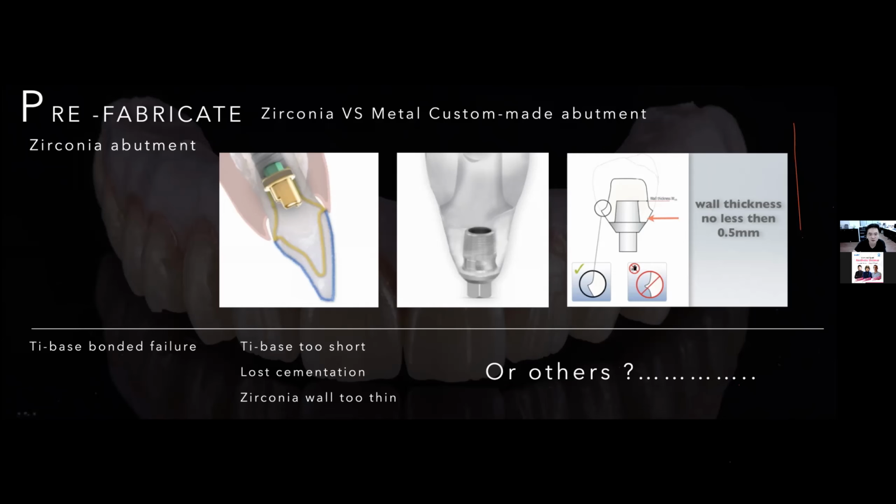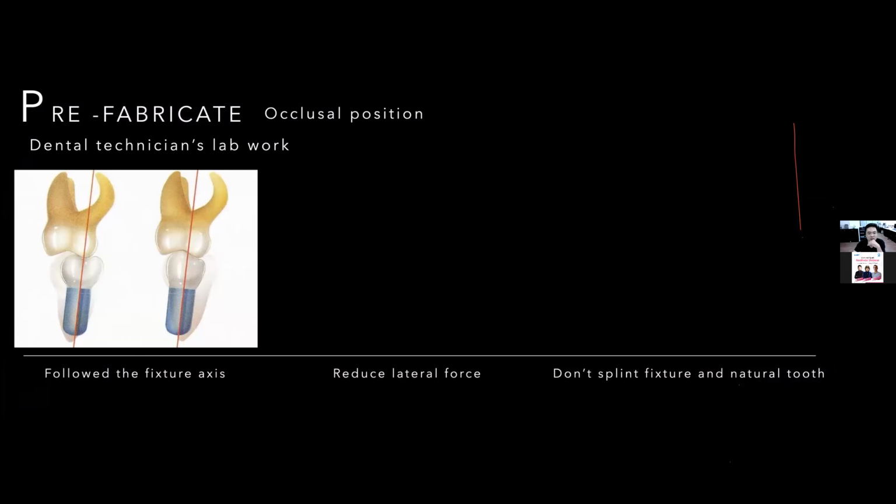This is very important. And another interesting point is about when we want to create the implant restoration. We must take care about the occlusal position and the bite area. But I must state that this key point is very competitive, because it's not totally about the technician's work and the technician's job. This responsibility is partly on the dentist. So I don't want to discuss or explain too much or too deep. I'll just tell you to make sure of 3 things.